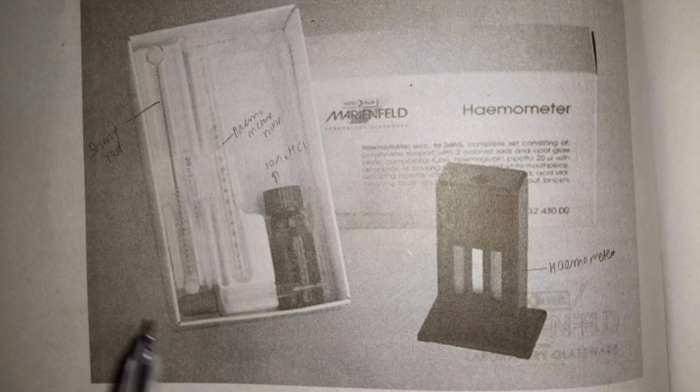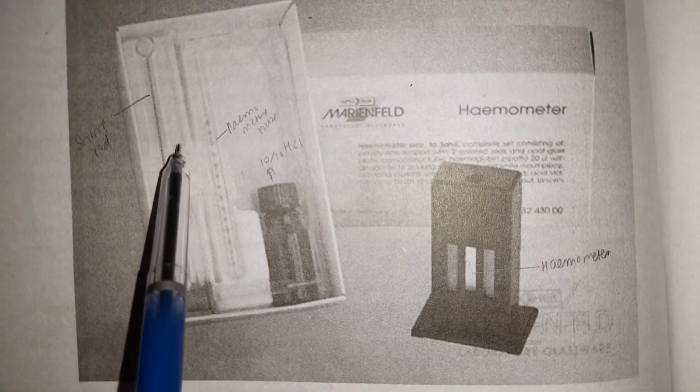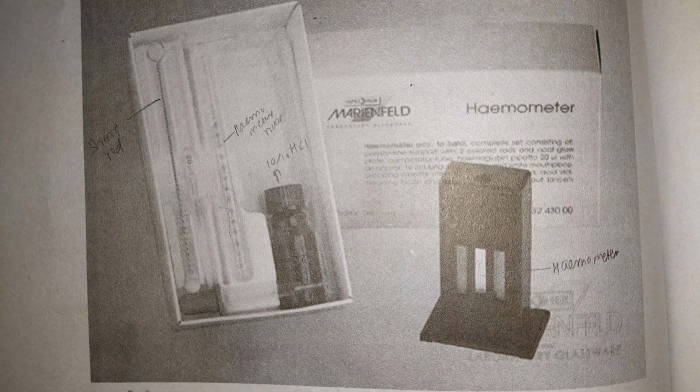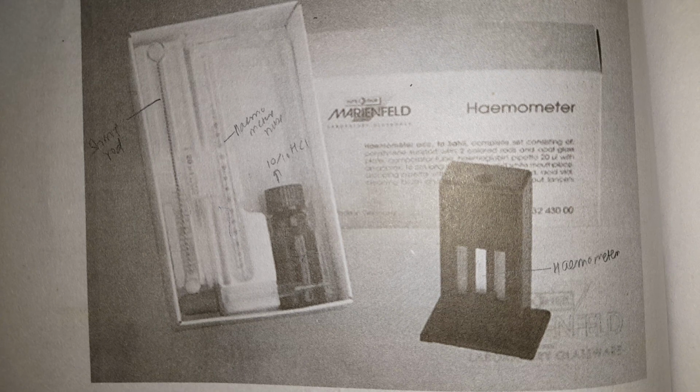Now, this is also the Sahli's apparatus that's mentioned in your book, the comparator box, where the graduated tube will be placed. Then this was the stirrer. Then we had the hemoglobin tube, a pipette, and then this is the N by 10 HCl. So this is how you can learn the Sahli's method for the determination of hemoglobin.